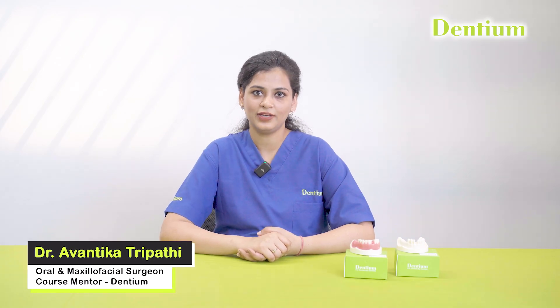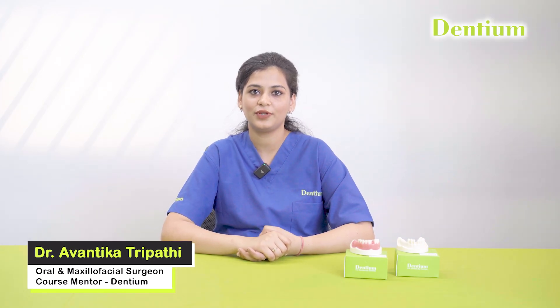Hi, I am Dr. Avantika Tripathi, Oral and Maxillofacial Surgeon, course mentor at Dentium. Today I will be demonstrating the step-by-step process of taking an impression using the open tray impression technique for a Dentium Superline implant on a dummy model. This method ensures accuracy in capturing the implant position, which is essential for a precise and well-fitting prosthesis. So let's get started.